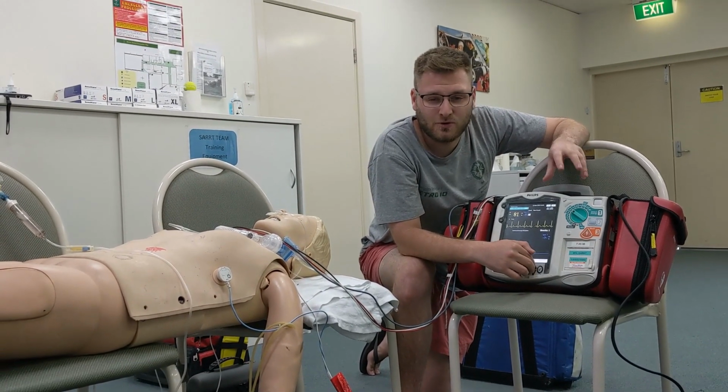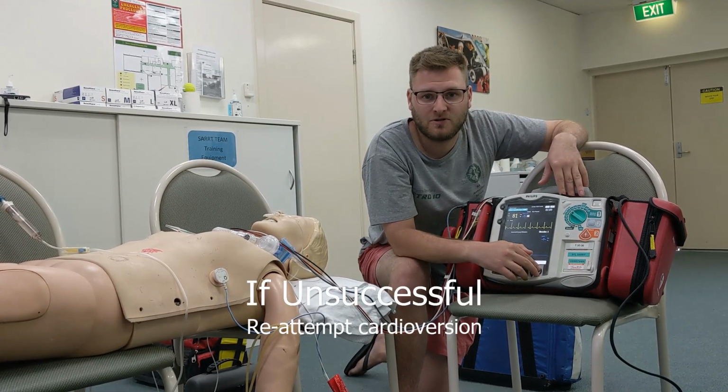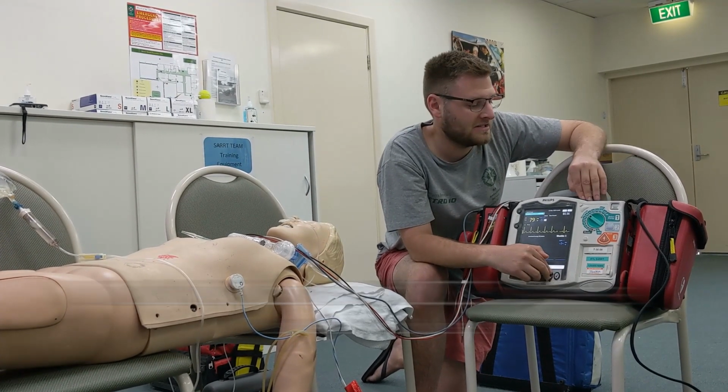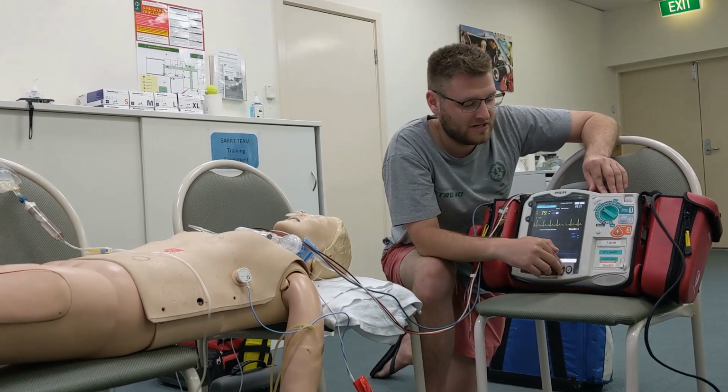In the situation where it has not improved, we can then reattempt the cardioversion another 2 times, and each time we can double the dose as per most research suggests, or as per whatever your local clinical practice guidelines suggest.